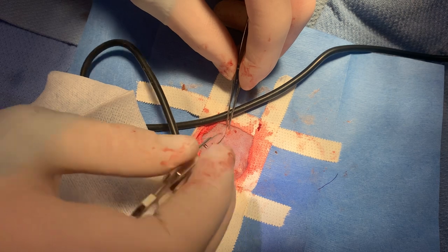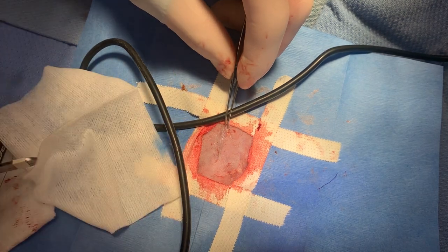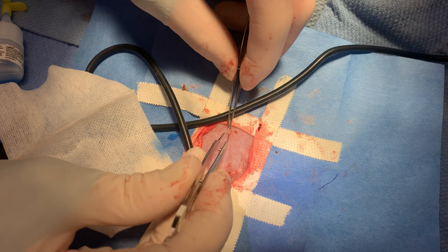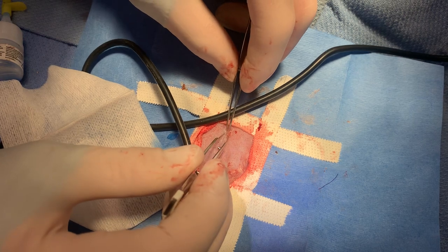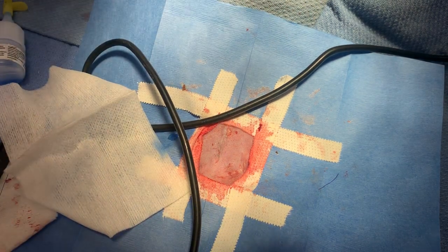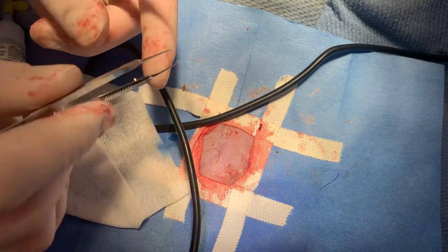Precise here, but the last thing I want is for you to do well from surgery and then have a suture reaction and chew your belly open. I mean a foreign body reaction to the glue. Hopefully that holds it closed but doesn't cause too much discomfort. That should be really good.